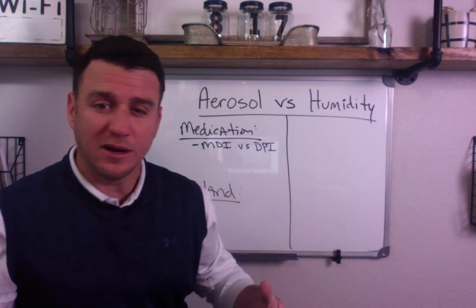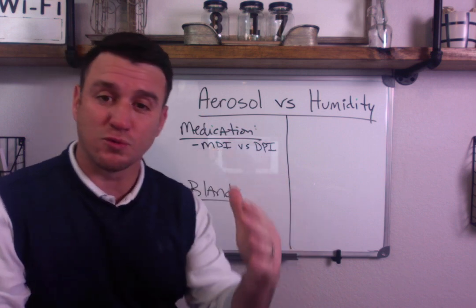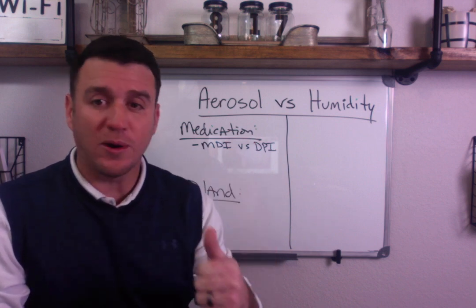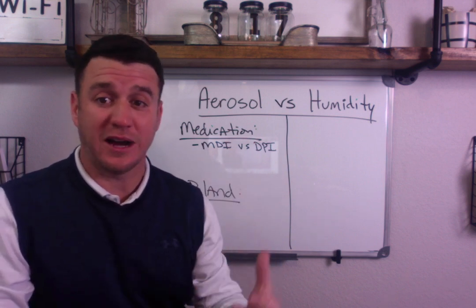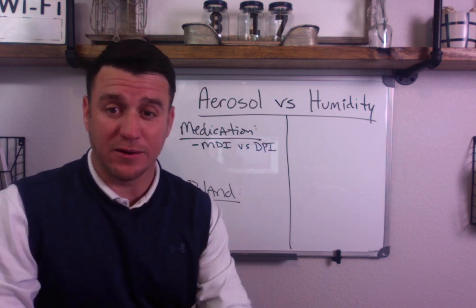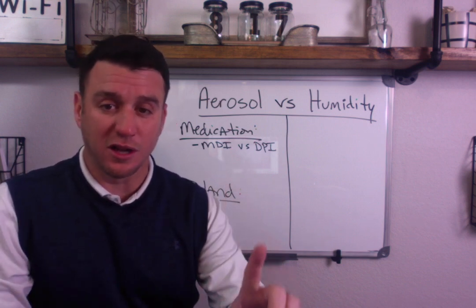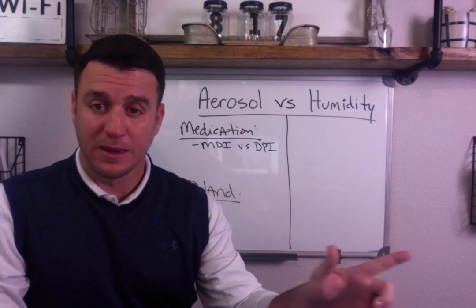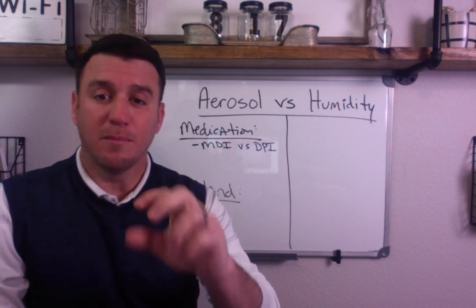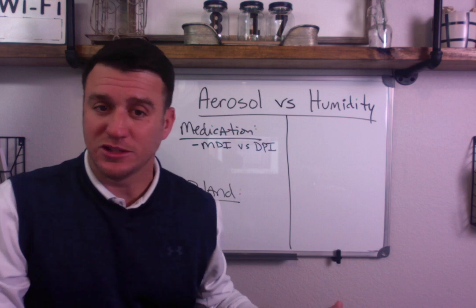So why am I bringing this up? Well, the reason being is because when you talk about MDI versus DPI as a respiratory therapist, you have got to understand, how do I instruct my patient to do these devices and how are they different? Okay, here it goes. You ready? Write this down if you're taking notes. In MDI, you want the patient to breathe slow and deep with an inspiratory hold at the end. Slow and deep will maximize deposition in the airways, which is what you're trying to get the medication to.